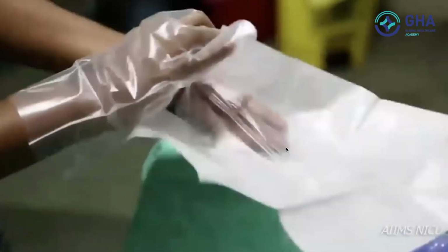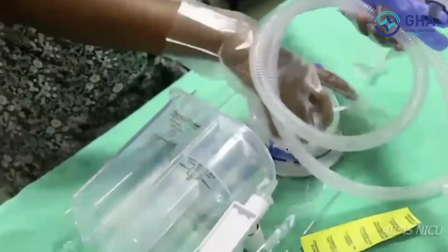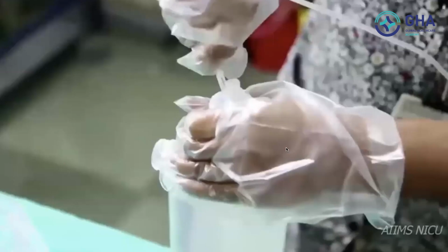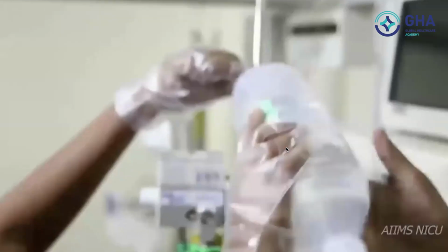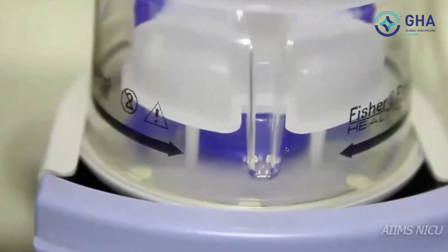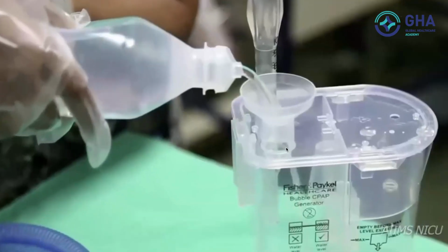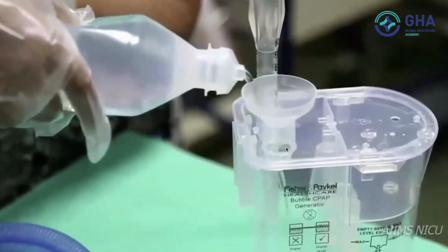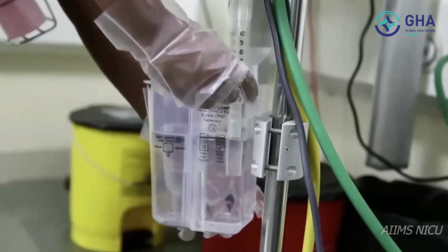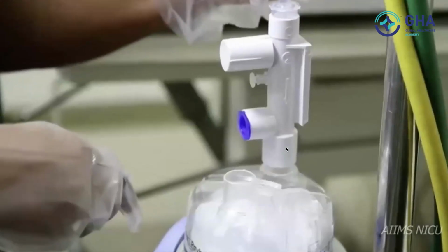and wearing clean gloves, open the disposable CPAP circuit. Fix the water chamber onto the servo humidifier and fill it with distilled water. Use the autofill option of fixing the distilled water bottle to a stand for filling the water chamber. Fill the bubble chamber with clean or distilled water and fix it to a slot available on the CPAP machine stand. Now fit the safety device between the flow meter and the water chamber of humidifier using the green gas tubing.